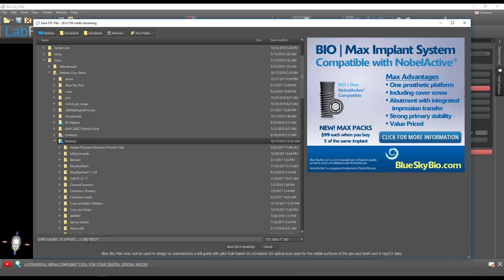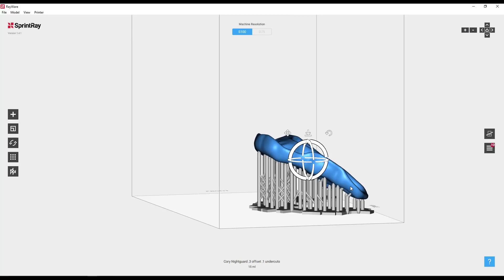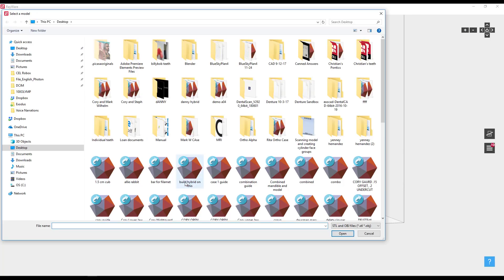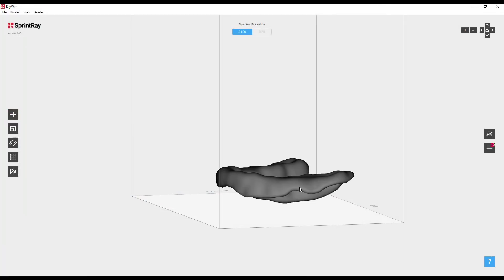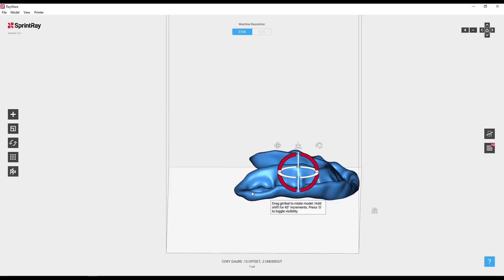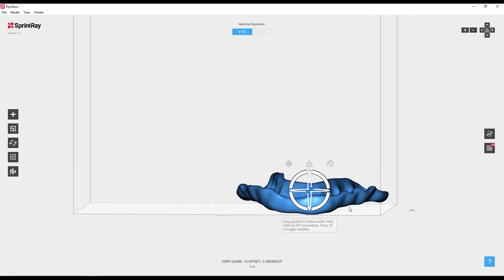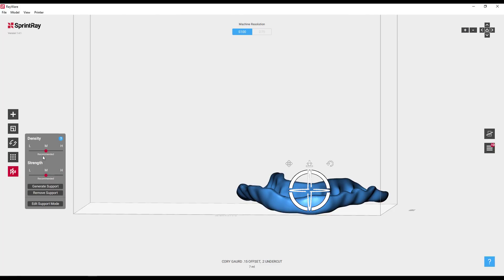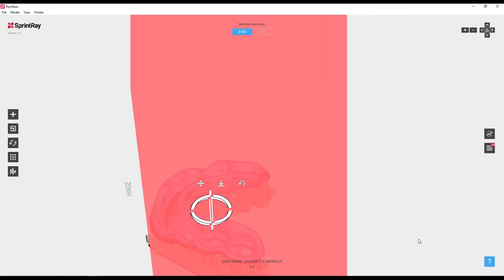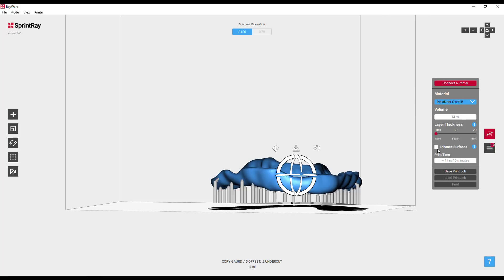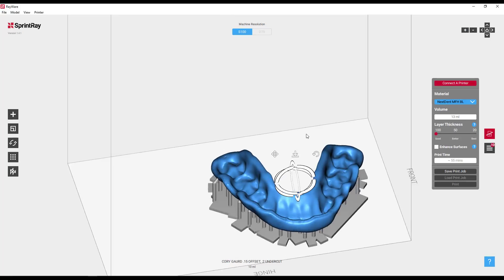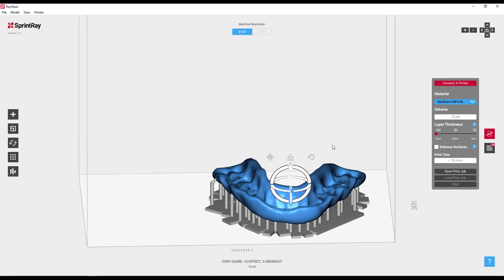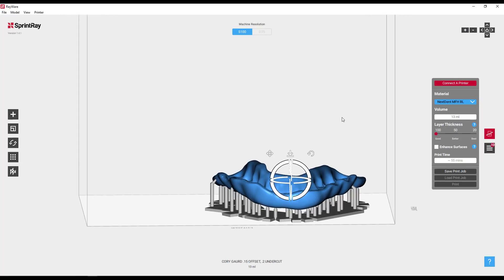Label this and do a few on yourself, test the fit. If you like the fit, remember that setting and just do it on everybody from there out. Now we're ready to print. I'm using the Moonray printer plus. We're going to grab Cory night guard. You would not want to print this with the intaglio down because that will affect the fit. You could lay it down flat. You're going to need to support it. If I'm printing something flat like this, I usually do medium on the supports.